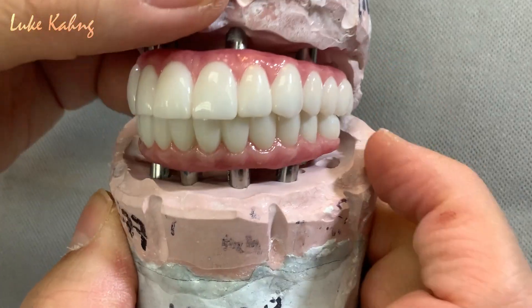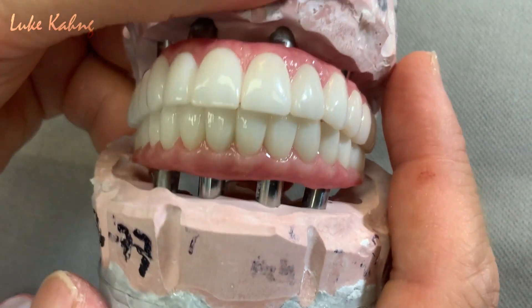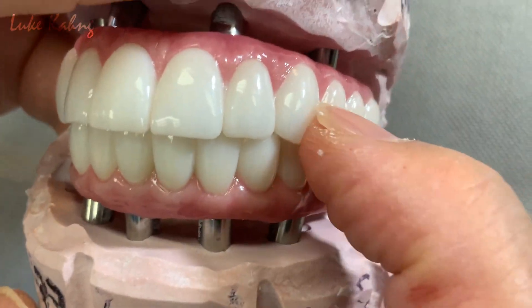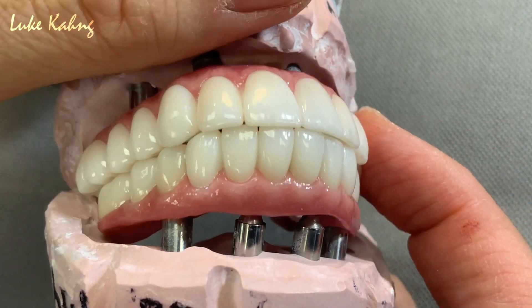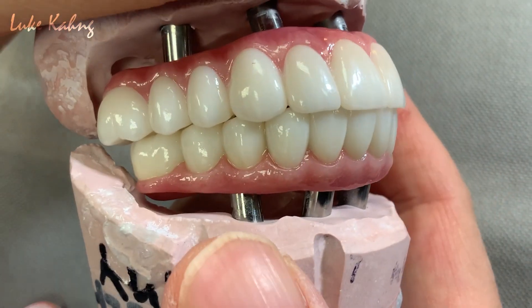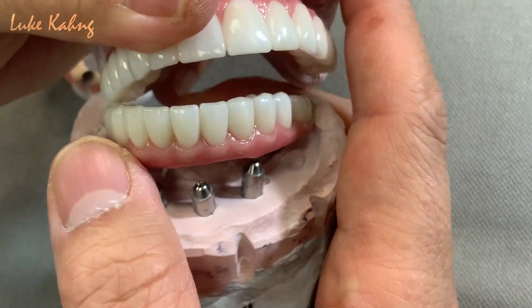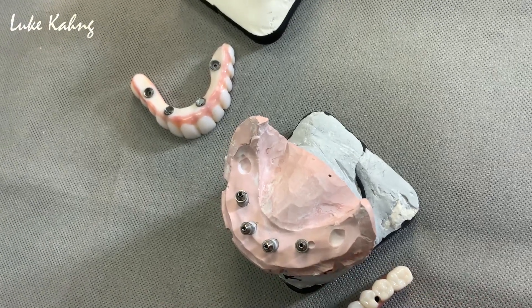On the one side we set up this lower and accomplished the upper just the same as the occlusion contact. So that one is the final — we especially like the midline together and the buccal corridor, canine. This is the highest aesthetics — we finished it.